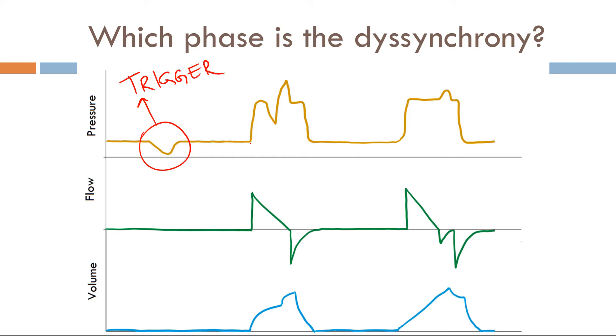Now moving along here, this breath is being triggered and the trigger variable is time because there's no negative deflection. So trigger is not an issue, but once it's triggered, the issue arises right here during the target phase. Therefore, this is a target dyssynchrony.